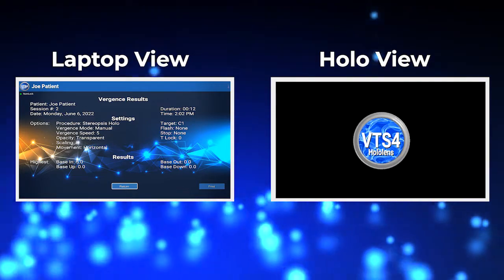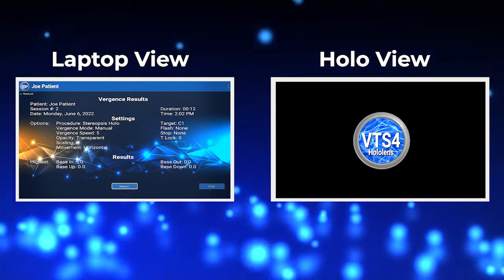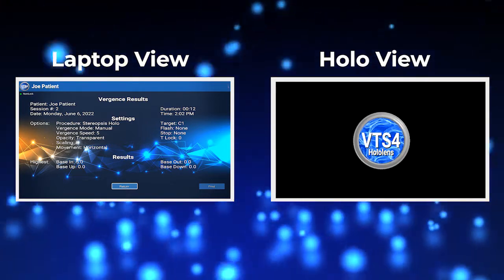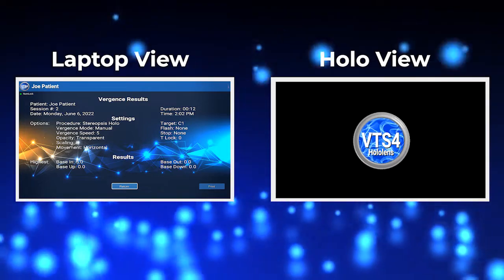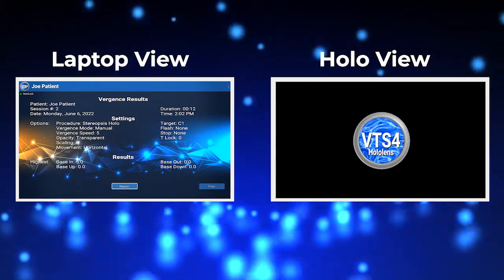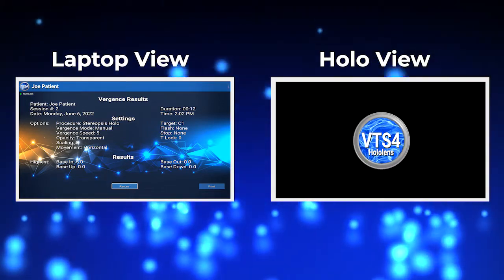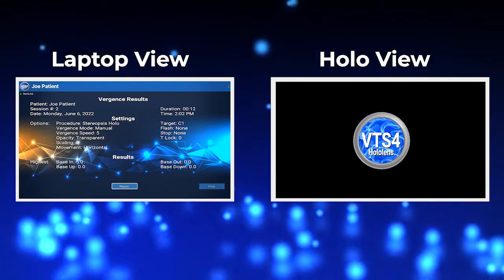If you wish to continue using the VTS4 HoloLens but want to show your patient the on-screen scores, you may flip the visor up. Flip the visor back down before proceeding to another procedure. If you are finished with the VTS4 for a particular patient, while on the results screen, it is now okay to remove the headset.